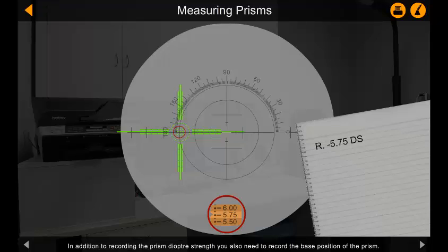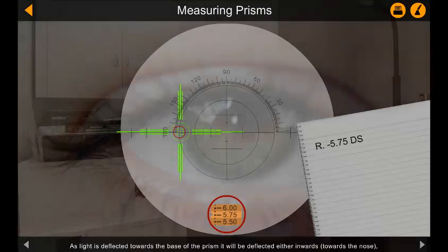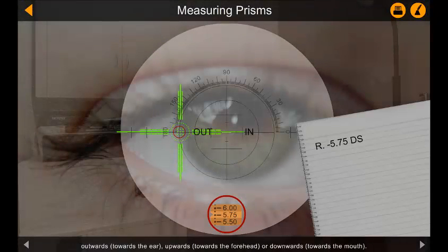In addition to recording the prism diopter strength, you also need to record the base position of the prism. As light is deflected towards the base of the prism, it will be deflected either inwards towards the nose, outwards towards the ear, upwards towards the forehead, or downwards towards the mouth.